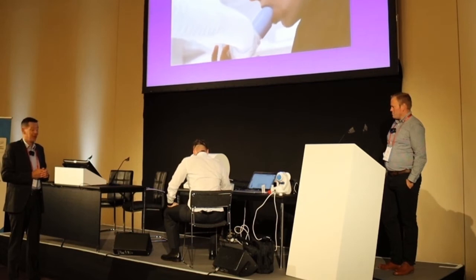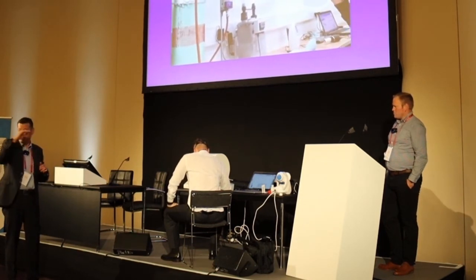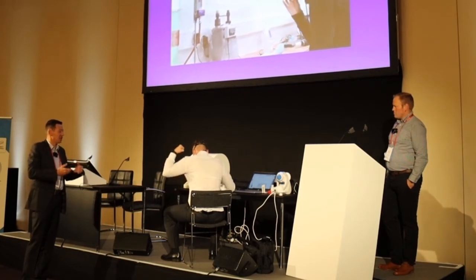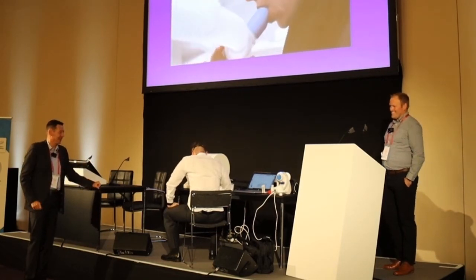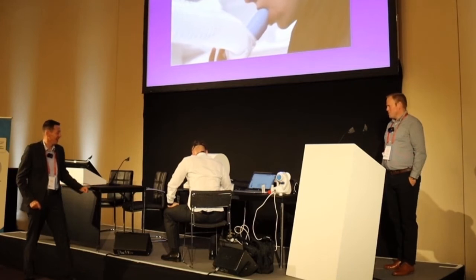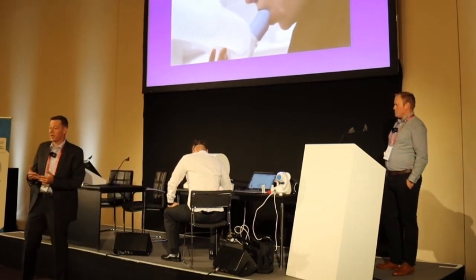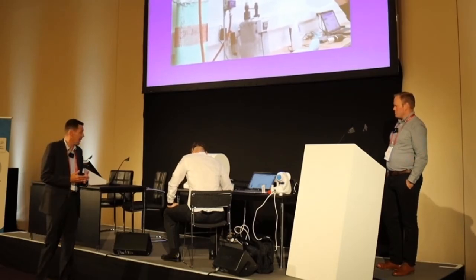I think it's enough. It's not the top athlete, just top medium, but you can see it's really challenging. But Benjamin did it several times. It's even counting the time, of course, so you always get the feedback on how long this task already took.